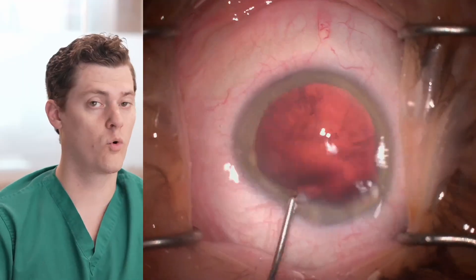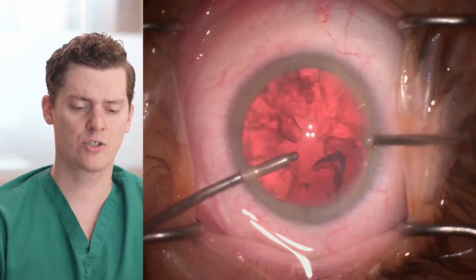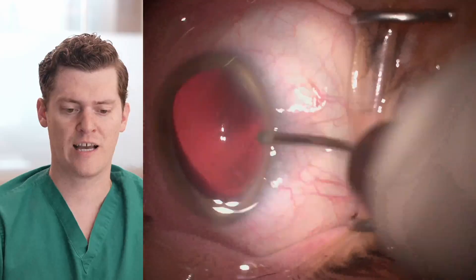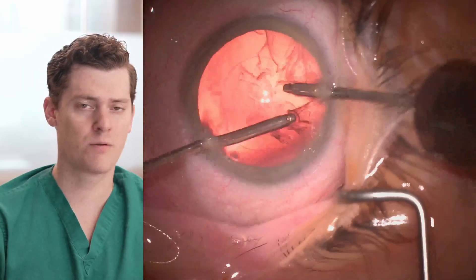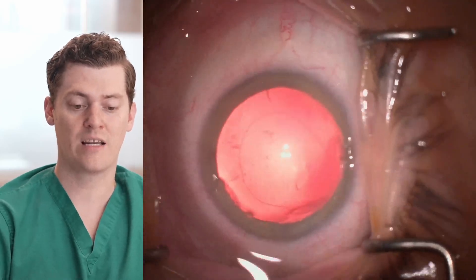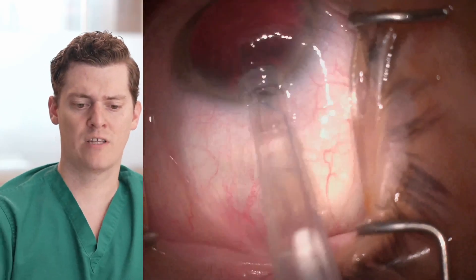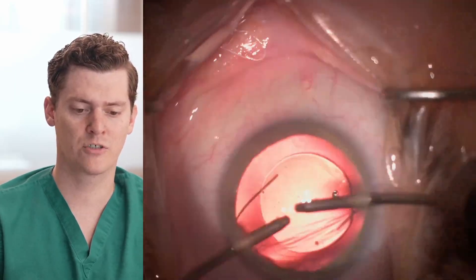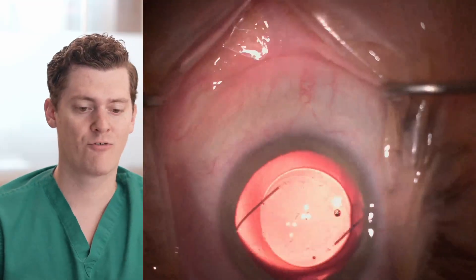Typically we use either coaxial or bimanual irrigation and aspiration — we have both readily available. In this situation, I used bimanual I/A to remove the cortex with a little bit more control and put less pressure on the capsule itself. The remaining cortex was then removed, the eye filled with viscoelastic, and a three-piece lens placed into the bag. We use the Bausch & Lomb SofPort lens as our standard monofocal lens, which gives us the ability to place it in the sulcus or in the bag. In this case, the bag was perfectly intact — just had a little bit of an AC run-out — and we were able to inject it in the bag and have a successful case.